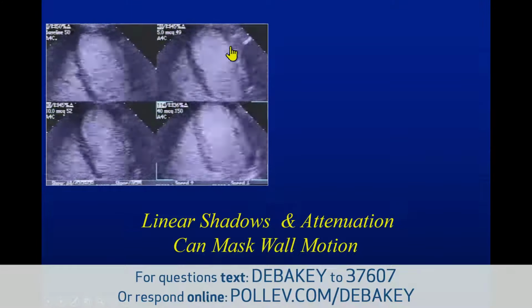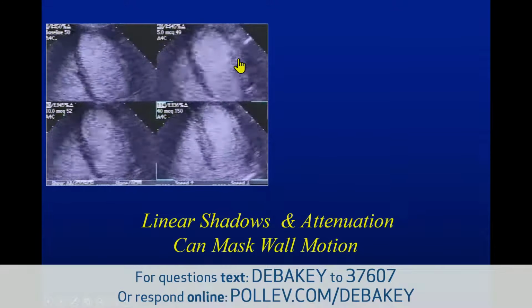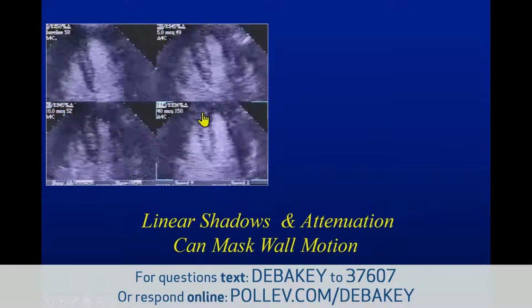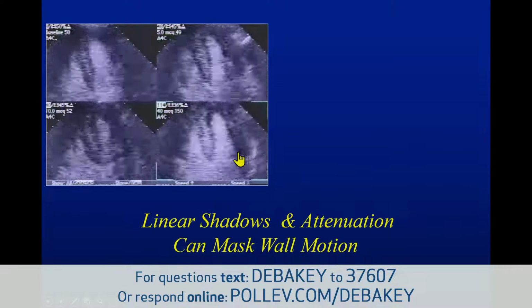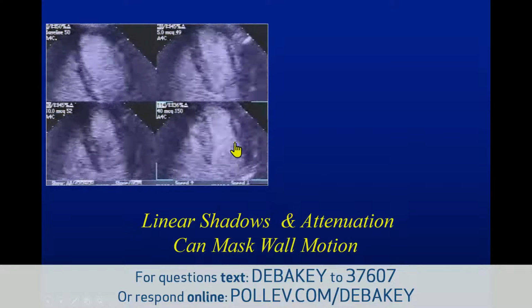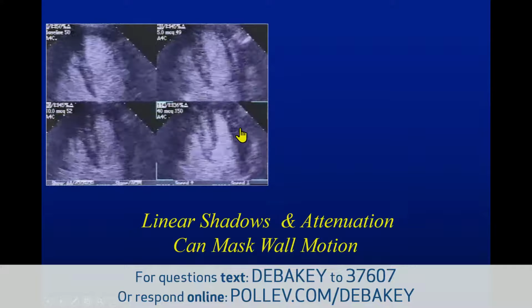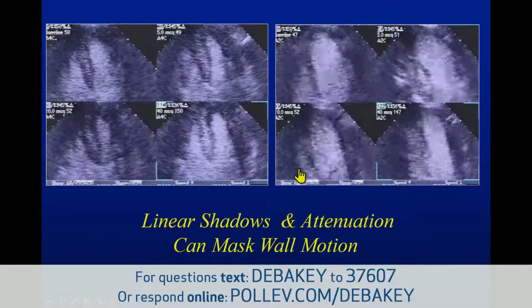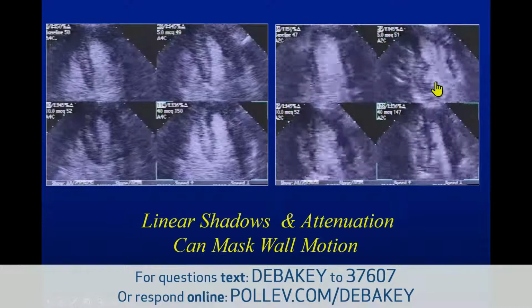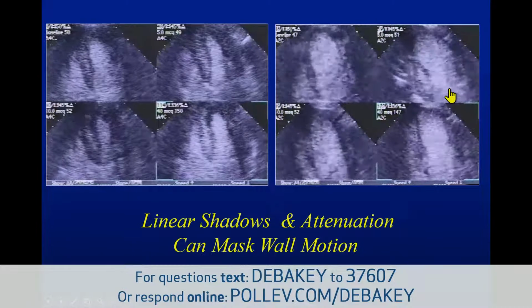See this linear structure that you could see shadowing? Actually the endocardium is just behind it. So you have to be very careful when you use contrast and you start seeing some linear structures. The heart is not straight linear, I would say, it is curvilinear. And the endocardium is actually behind it. This is the same case, again a magnification in the two-chamber view of this linear structure.